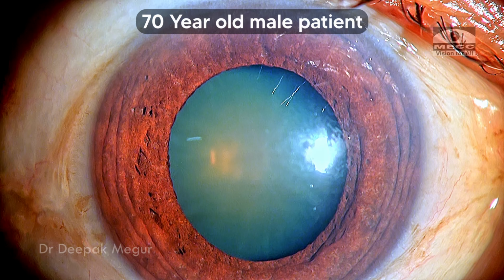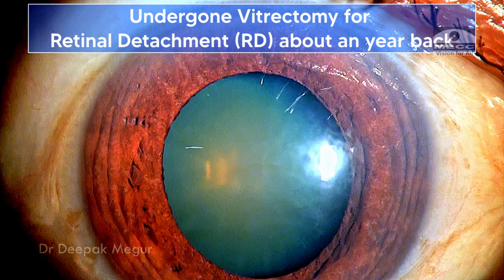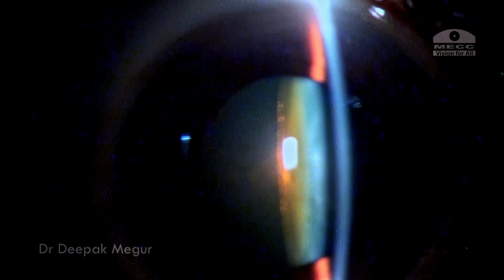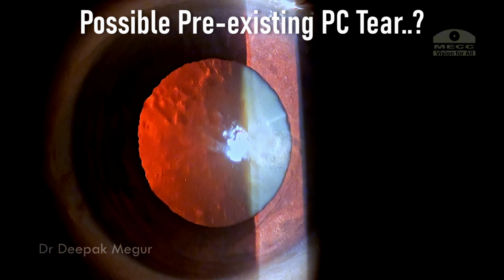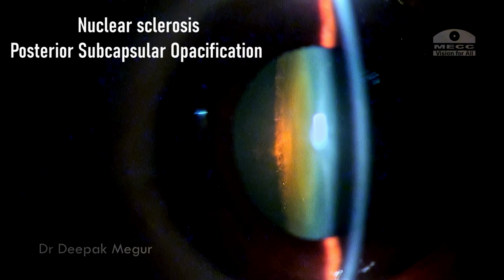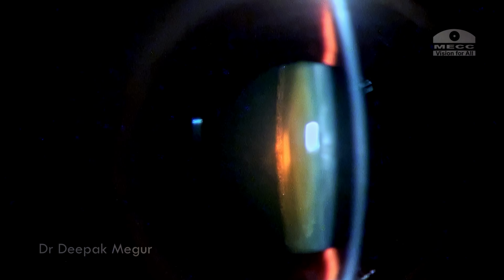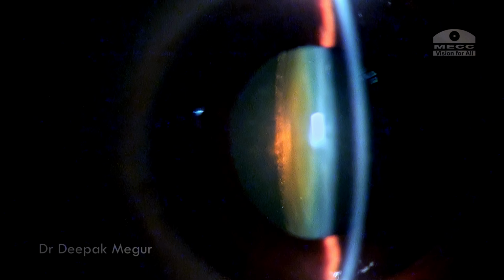He is a 70-year-old physician who has undergone vitrectomy for retinal detachment about a year back, and now has developed this cataract. And at slit lamp examination, I'm careful to analyze and see if there is any pre-existing posterior tear, which is a possibility when a patient undergoes vitrectomy. It looks fine. There is some amount of nucleus sclerosis along with the posterior subcapsular opacities. So at the slit lamp examination, it's critical to evaluate and rule out the presence of a pre-existing posterior tear.